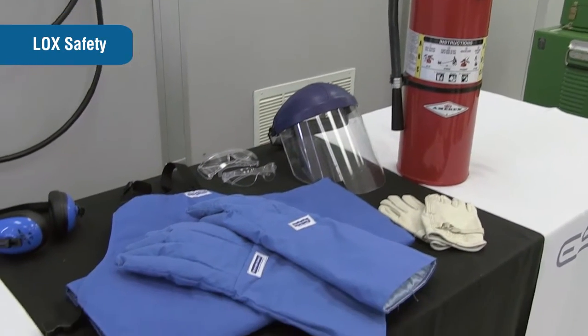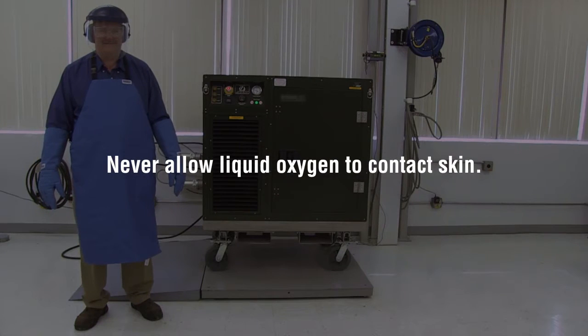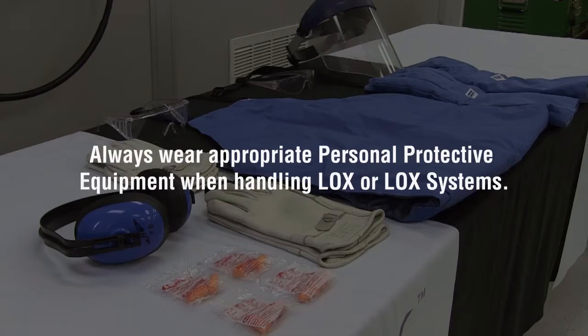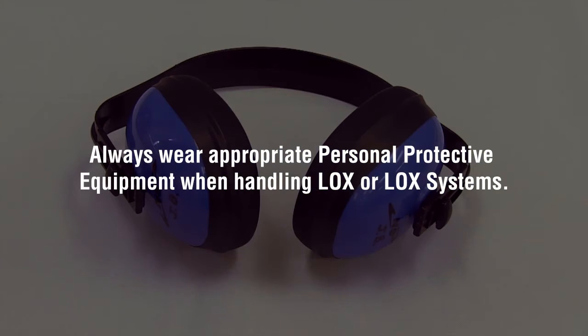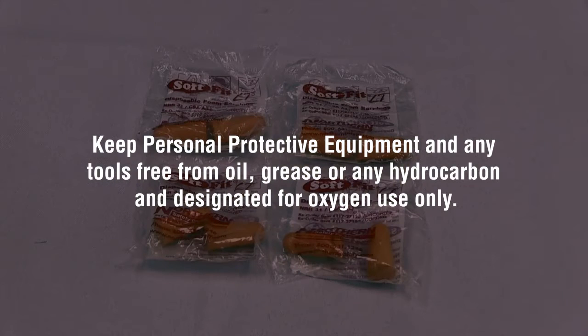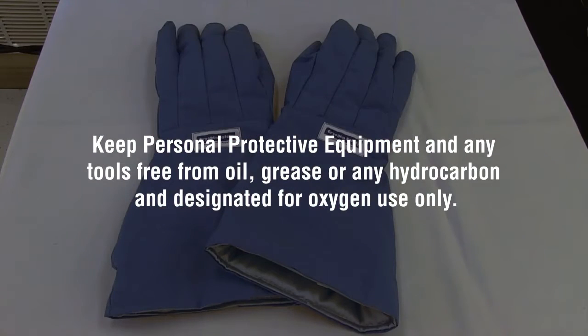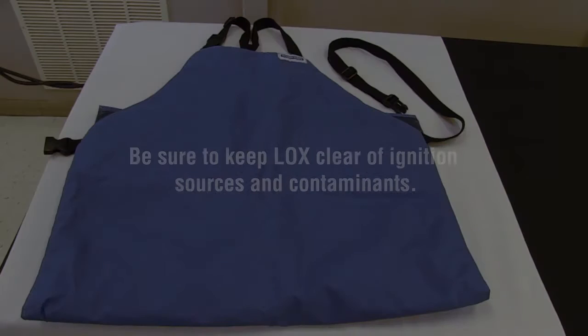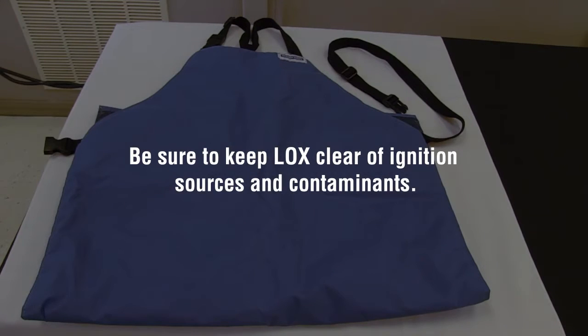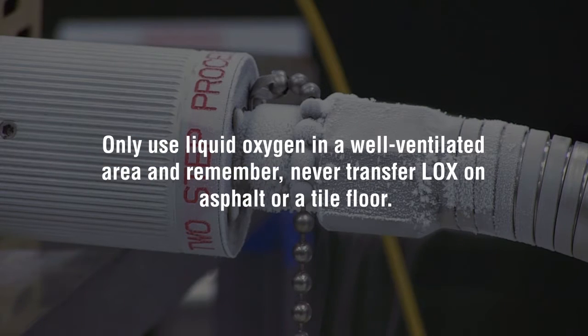First, it is important to review some points regarding LOX safety. Never allow liquid oxygen to contact skin. Always wear appropriate personal protective equipment when handling LOX or LOX systems. Keep personal protective equipment and any tools free from oil, grease, or any hydrocarbon and designated for oxygen use only. Be sure to keep LOX clear of ignition sources and contaminants. Only use liquid oxygen in a well-ventilated area. And remember, never transfer LOX on asphalt or a tile floor.